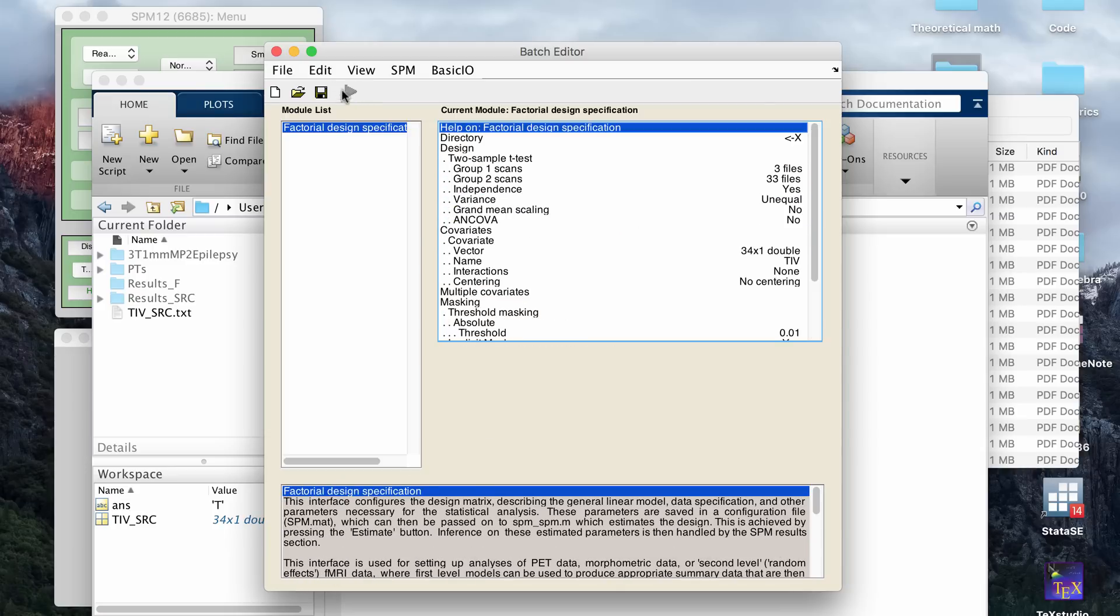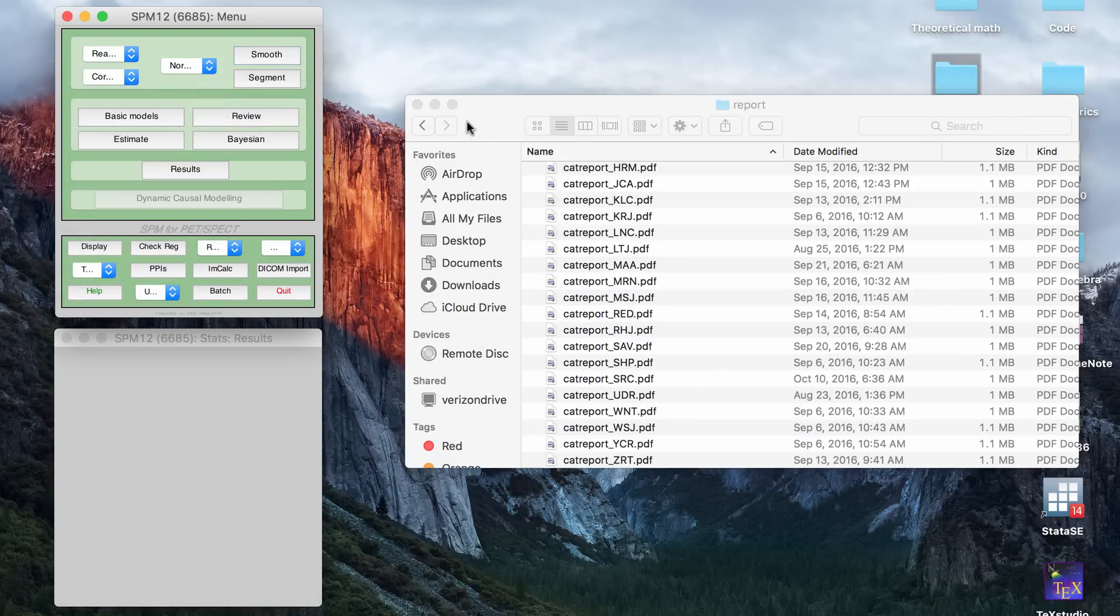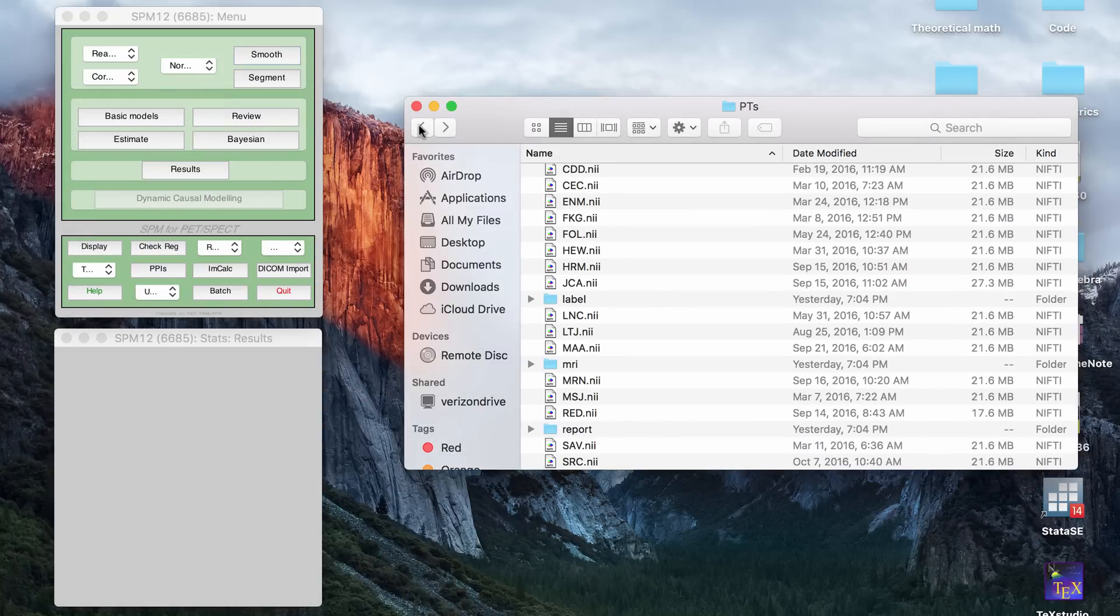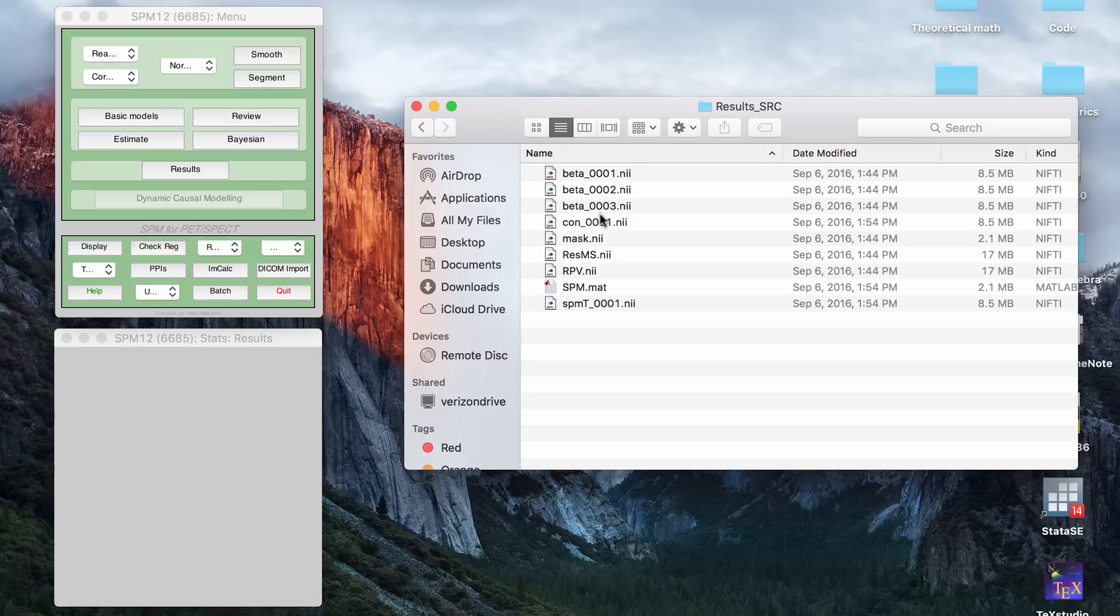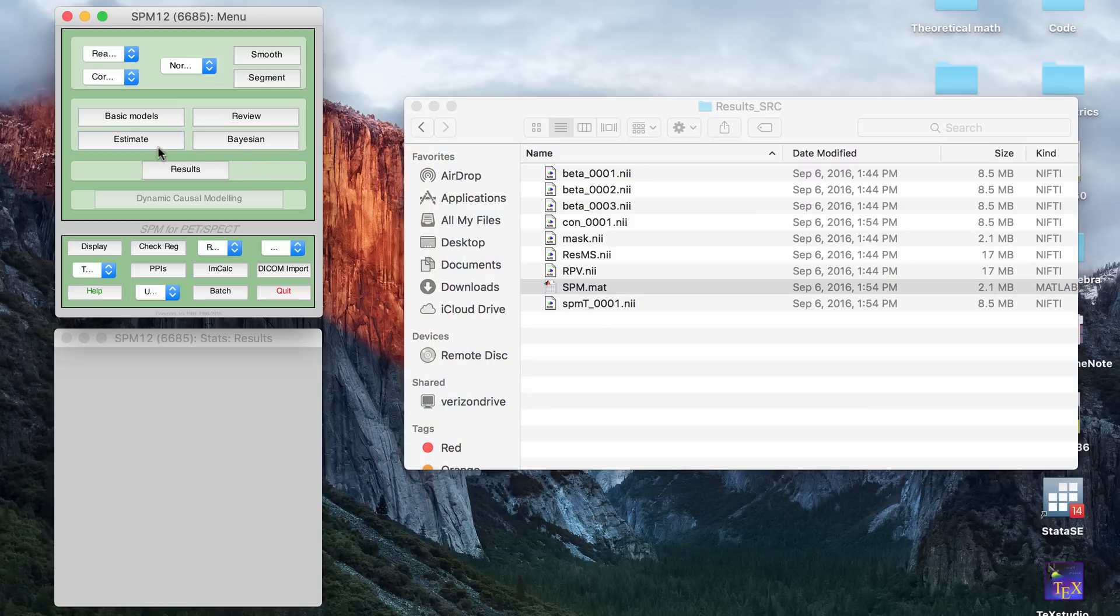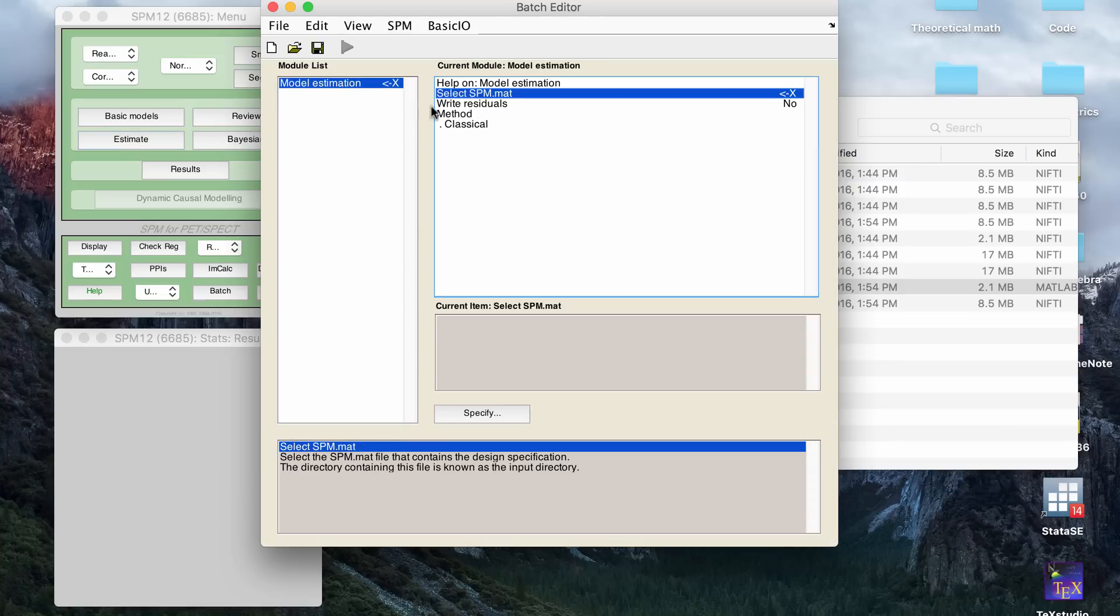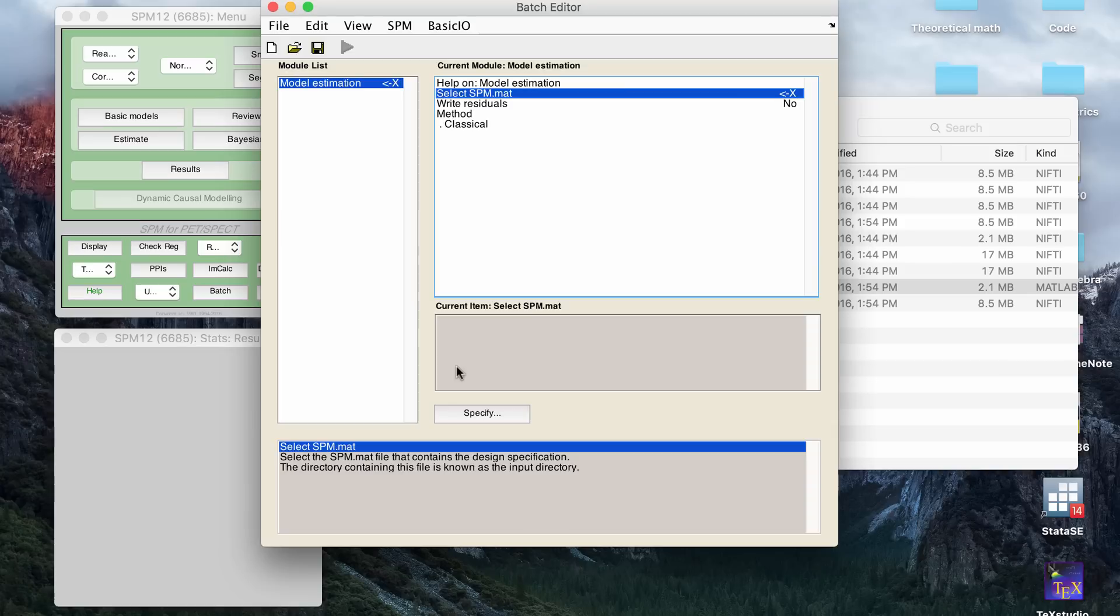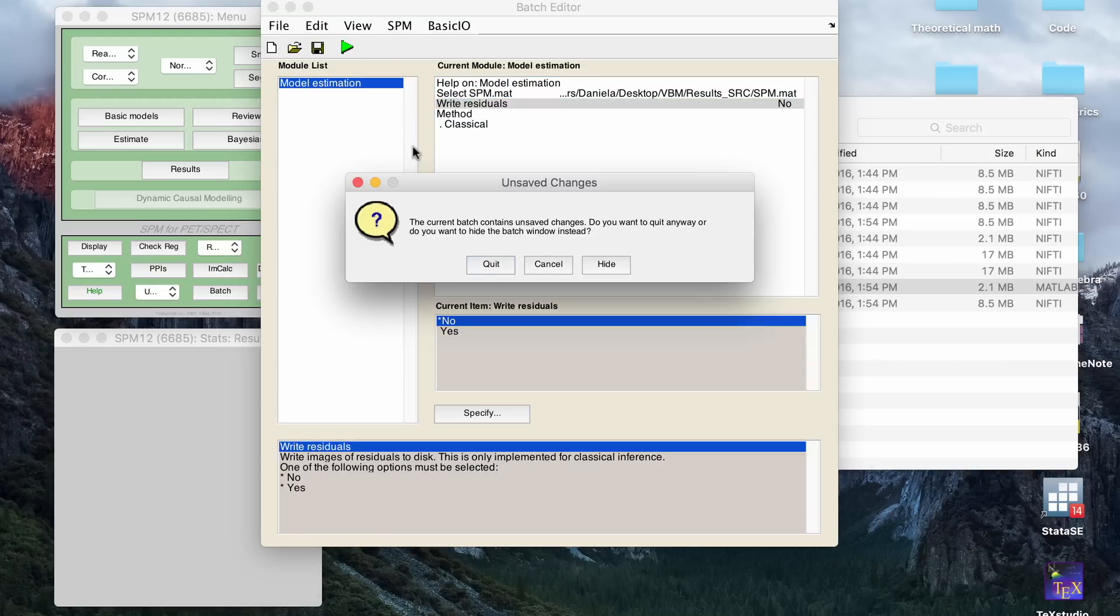And then once that's done, you can click the green arrow and that will run. Once that's finished running, that creates an SPM.mat file in your results folder. And what you're going to do is you're going to want to estimate that. And so you have to go to the SPM GUI, click estimate, then you click your SPM.mat file. And again, I don't change any of these defaults. You click the green button and that will run.